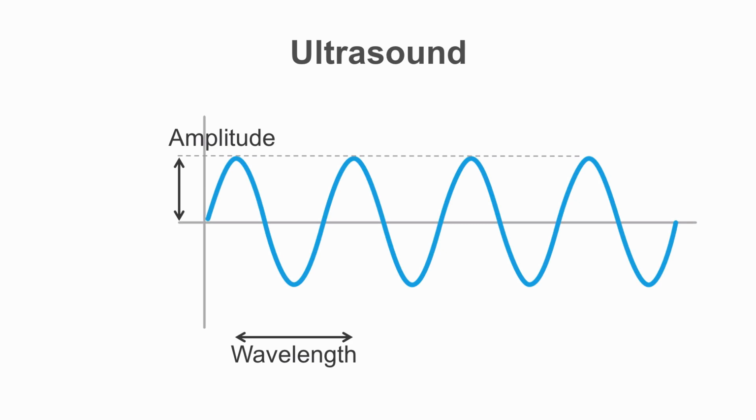However, the trade-off is that the high frequency waveforms have reduced penetration. So as an echocardiographer, you're going to be making judgments about the frequency you want to use in a given situation. The velocity of the beam depends on the characteristics of the medium it's actually travelling in.